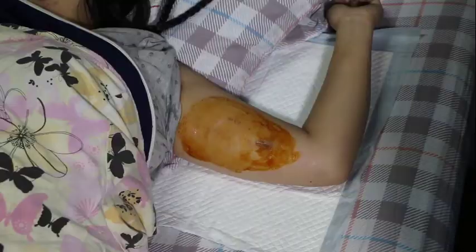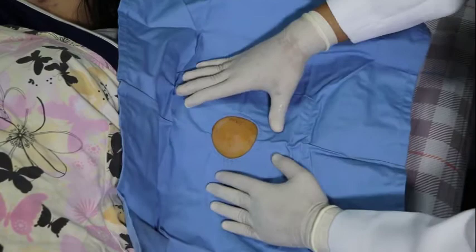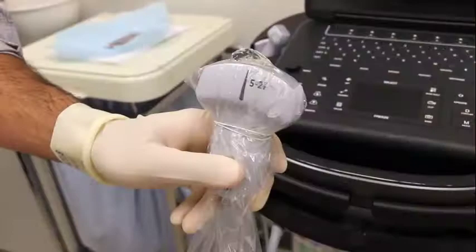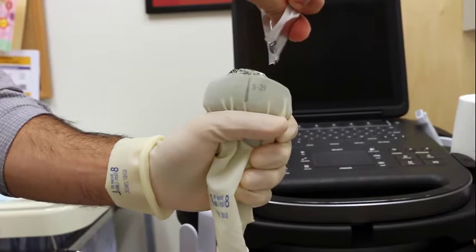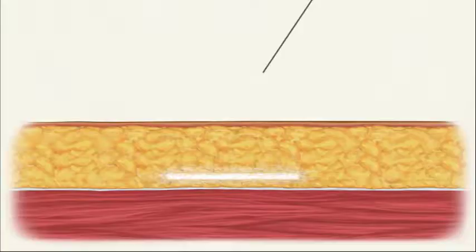Alternatively, sterile drape the area around the incision site. If using ultrasound for the removal, put a sterile cover, condom, or sterile glove on the ultrasound probe. Place gel directly on the probe and on the skin. Use ultrasound to visualize the injection of anesthetic. Ensure the injection tract goes down to the implant. Inject underneath the implant and in the vicinity of the implant to fully anesthetize the incision site.